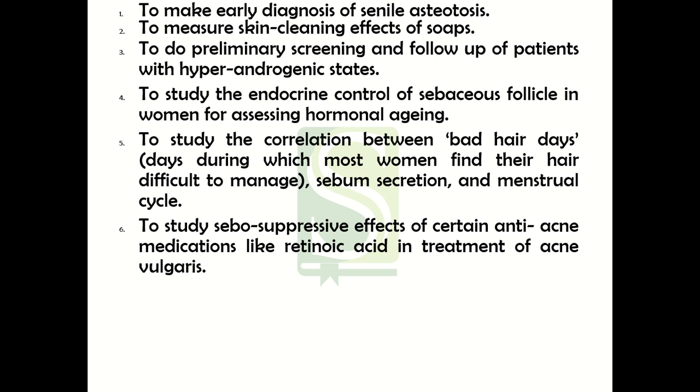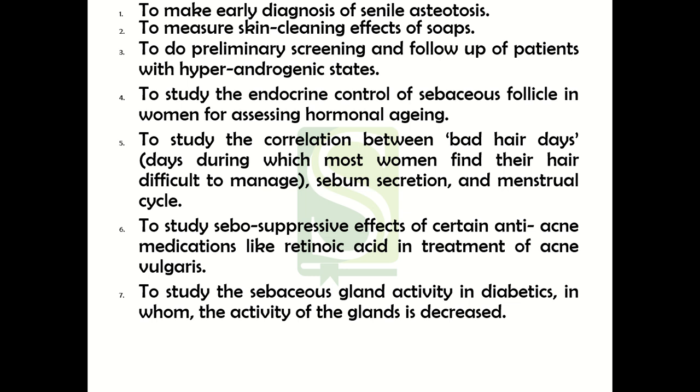It also helps you to study sebosuppressive effects of certain anti-acne medicines like retinoic acid, which is used in the treatment of acne vulgaris. It helps you to study the sebaceous gland activity in diabetic patients in whom the activity of the glands is decreased.